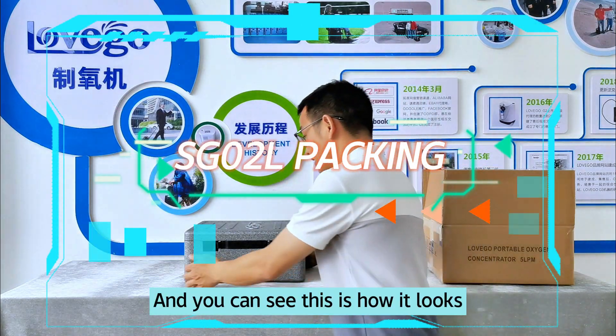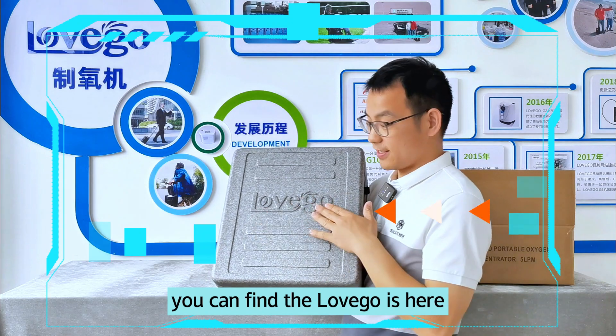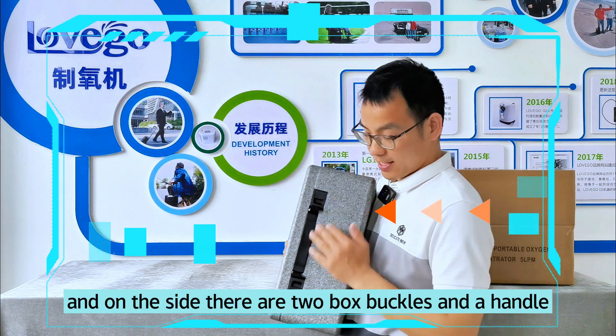And you can see this is how it looks. And on the other side, you can find that the logo is here. And on the side, there are two box buckles and a handle.